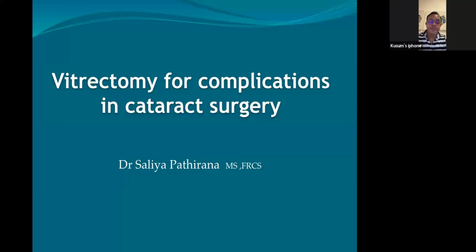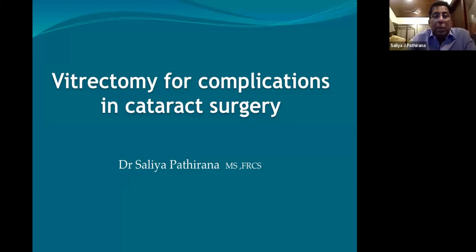Okay, good evening, everybody. Now, my topic is to discuss the retained lens matter. Usually for retained lens matter, we have to do vitrectomy. That's why I have put the topic as vitrectomy for complicated cataract surgery.